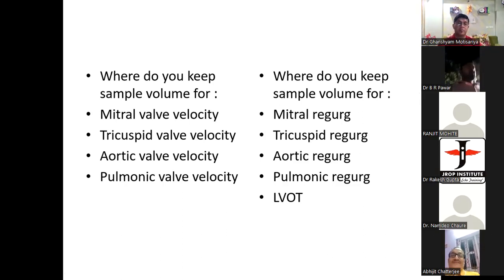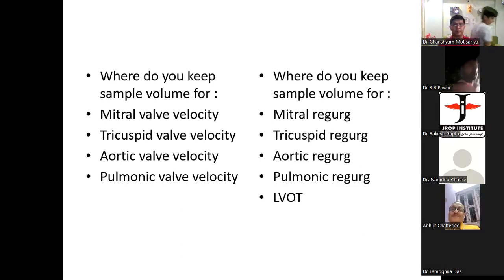He must be thinking I'm getting 5 questions in one go. Namdev, very simple. You have to mix and match. Where do you keep the sample volume for mitral velocity? At the tip of the mitral valve. Tricuspid valve? Also at the tip of the tricuspid valve. Aortic valve?